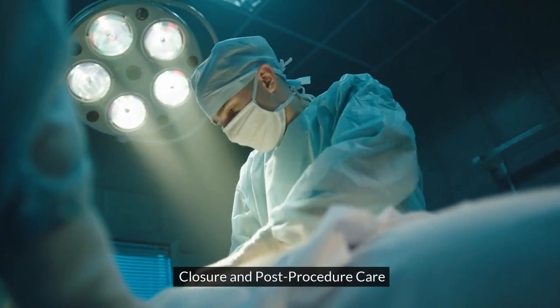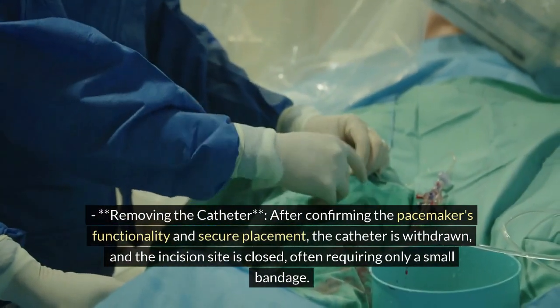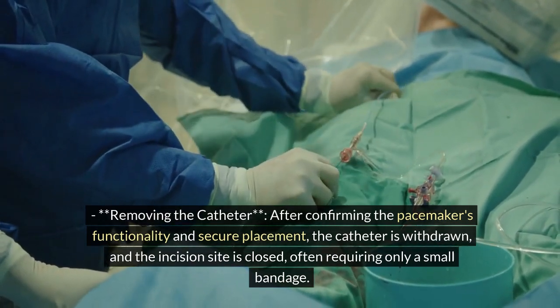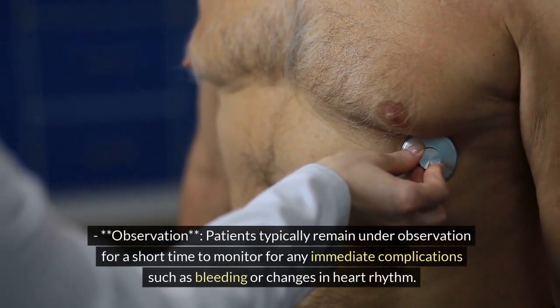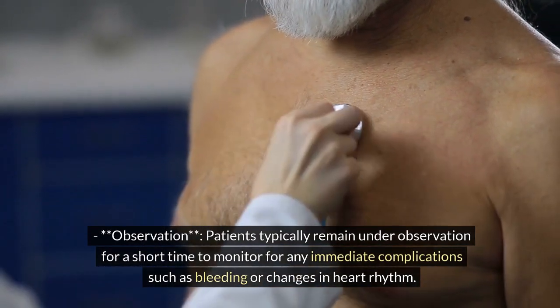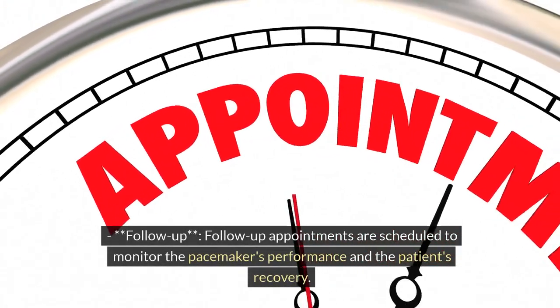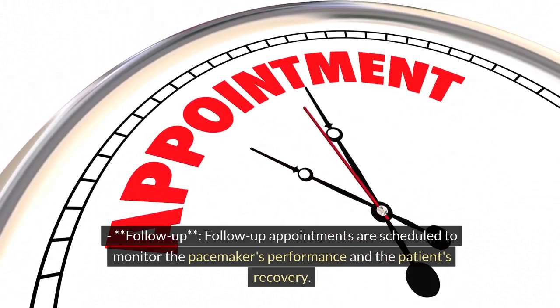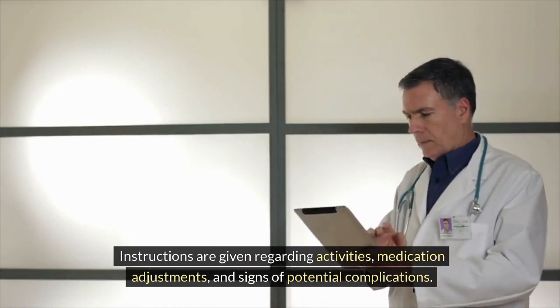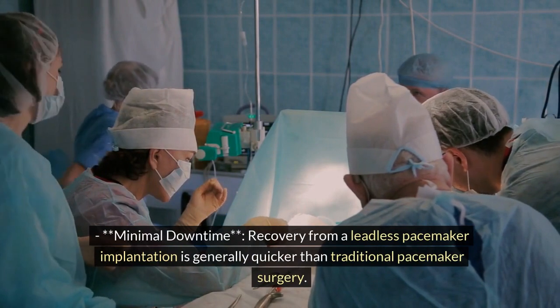Step 5: Closure and post-procedure care. Removing the catheter: after confirming the pacemaker's functionality and secure placement, the catheter is withdrawn and the incision site is closed, often requiring only a small bandage. Observation: patients typically remain under observation for a short time to monitor for any immediate complications such as bleeding or changes in heart rhythm. Follow-up: follow-up appointments are scheduled to monitor the pacemaker's performance and the patient's recovery.